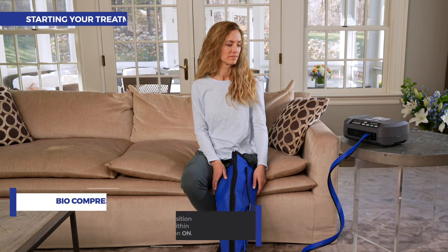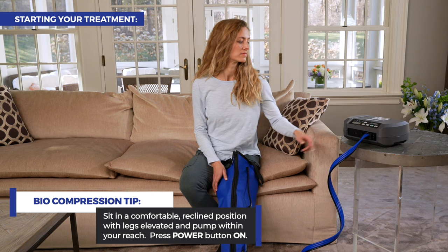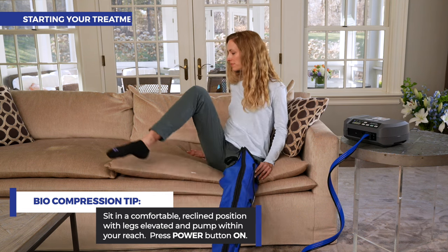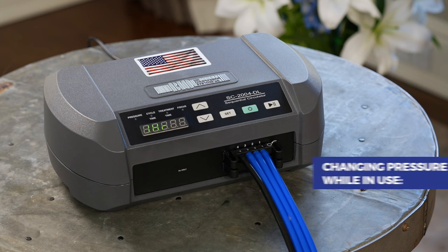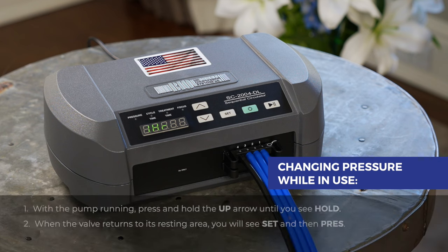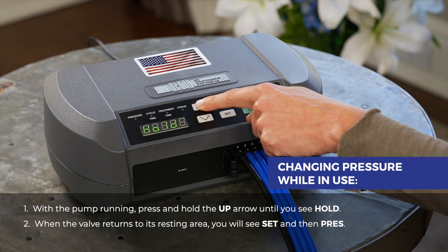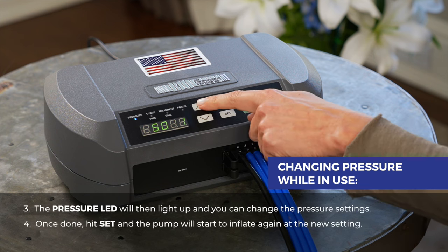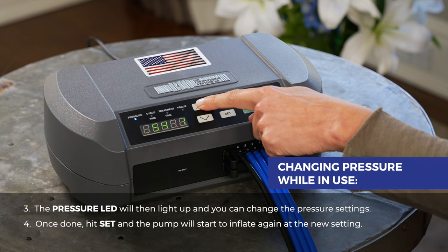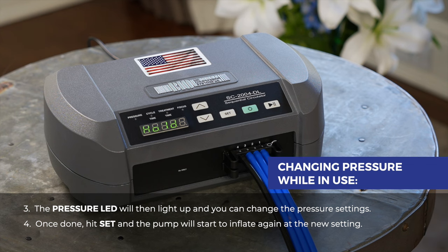To start your treatment, sit in a comfortable reclined position with your legs elevated and pump within your reach. Press the power button on. The settings will appear on the LED display and the pump will start. To change the pressure setting while in use, press and hold the up arrow until you see hold. When the valve returns to its resting area, you will see SET and then PRES. The pressure LED will light up and you can change the pressure settings. Once done, hit set and the pump will start to inflate again at the new setting.